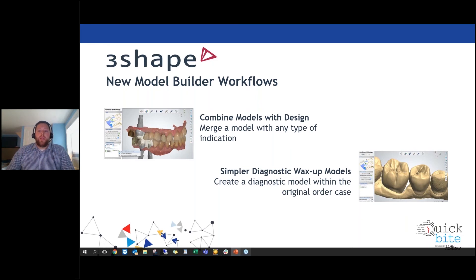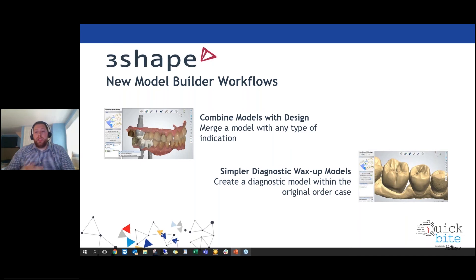Now let's look at model builder workflows. The first new workflow is the ability to combine models with design. A new step in the model builder allows you to merge a model or make space and gingiva for each individual restoration. It is now possible to merge a model with any type of indication — for example, combining a scan in a frame as a hand veneering guide or making an anatomical diagnostic wax-up. This was not previously available.